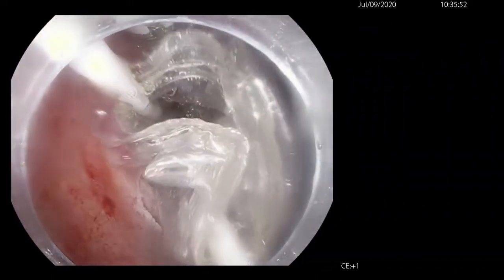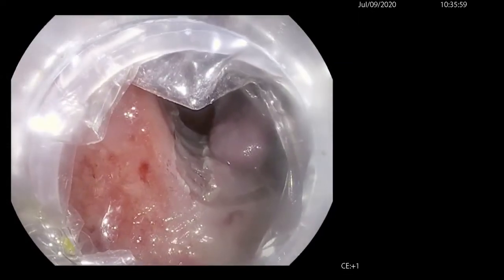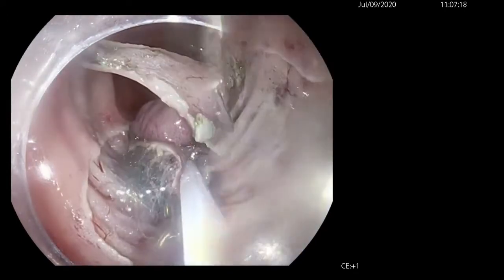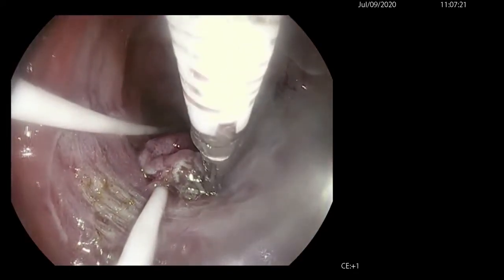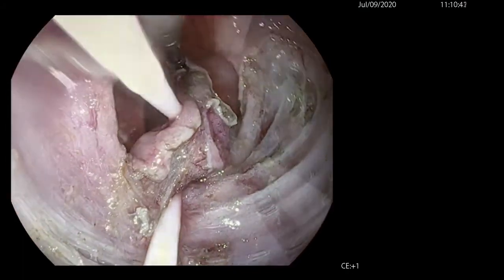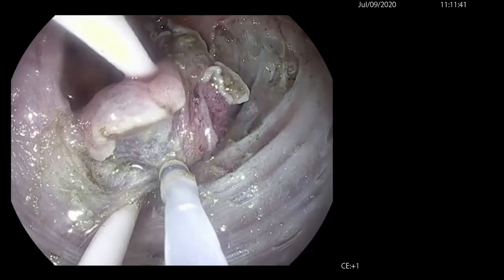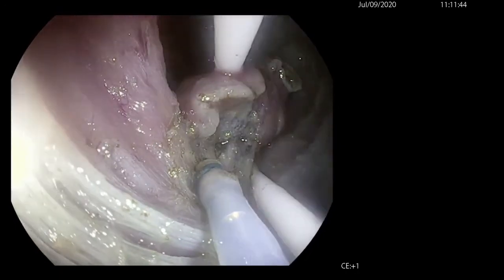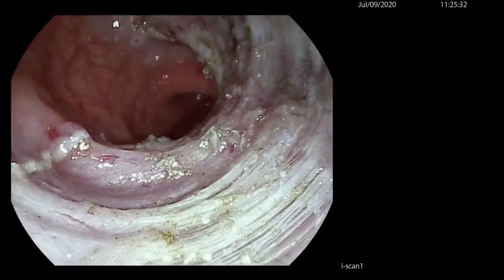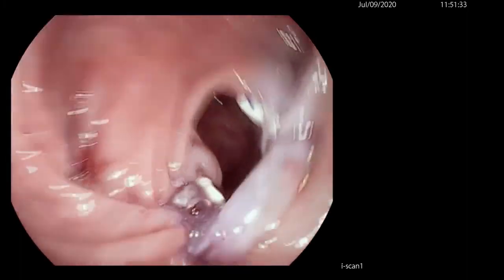After dissecting the majority of the lesion, the fore-balloon is retracted to allow submucosal injection of the other side of the lesion. The flexible grasper was then reoriented to grasp the edge of the lesion to allow the final dissection. As we can see here, we have very limited submucosal space, but we are still able to provide adequate tension to maintain the traction needed to perform the final cut of the lesion. The post-mucosectomy site was carefully inspected and showed no perforation. The site of the dissection was closed completely using an endoscopic suturing device.